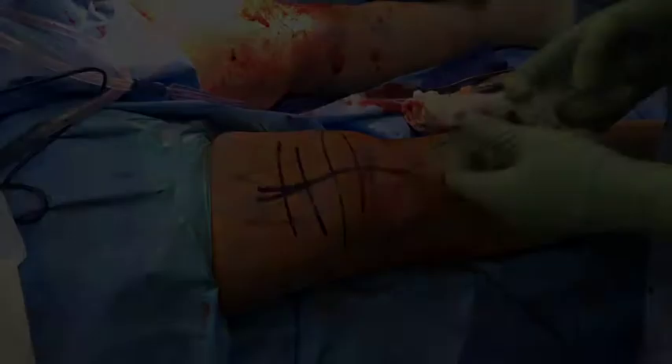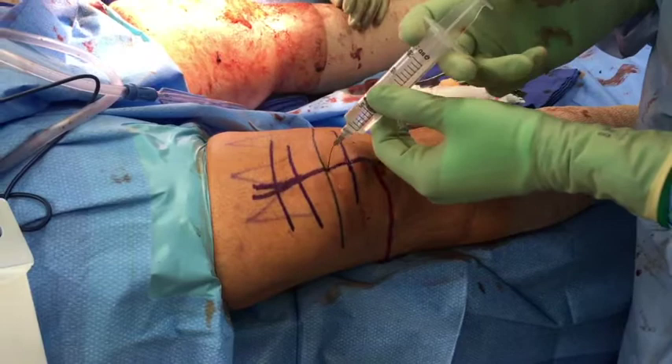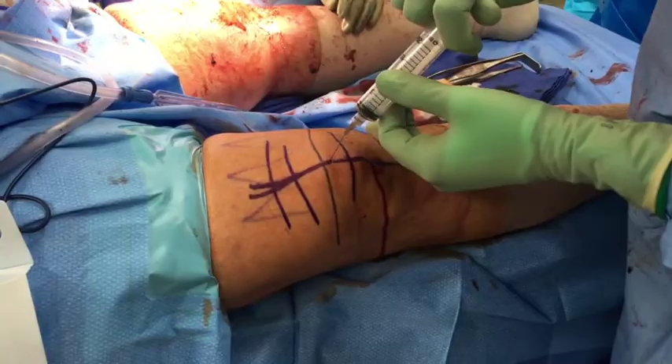The patient had bilateral tears and we have already fixed the contralateral side. We place a bump under the hip and a tourniquet on the thigh. We begin by infiltrating the skin and the tear site with Marcaine with epinephrine.